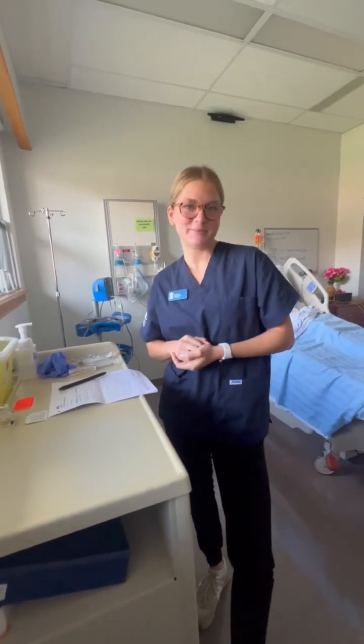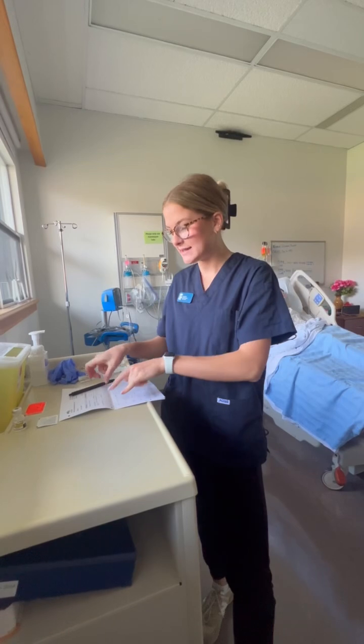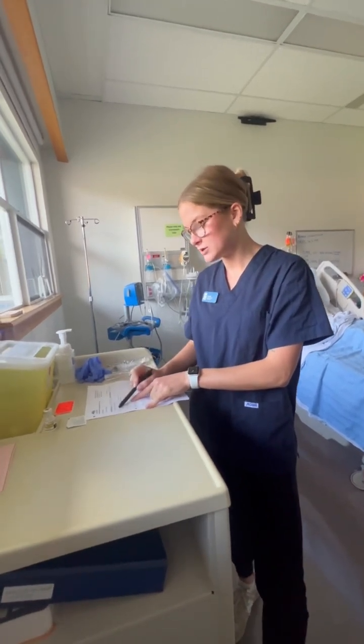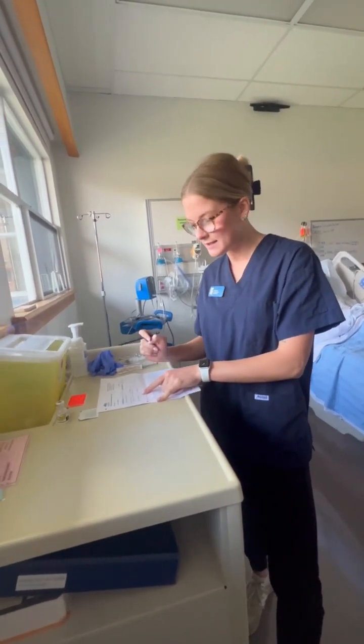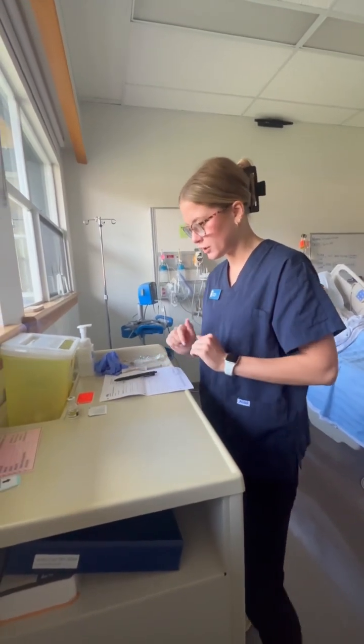Hello, my name is Naomi, and today I will be administering morphine to my client Elizabeth Bennett. She was complaining of 5 out of 10 pain earlier today, so I can see on her MAR that she does have a dose of morphine, 2 milligrams IV. She has not had a dose yet today, and so I'm going to get that prepared for her.